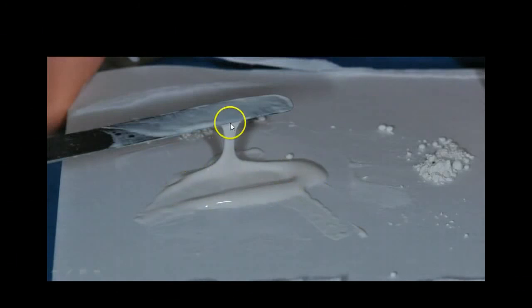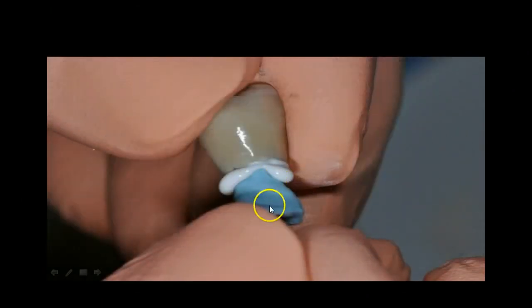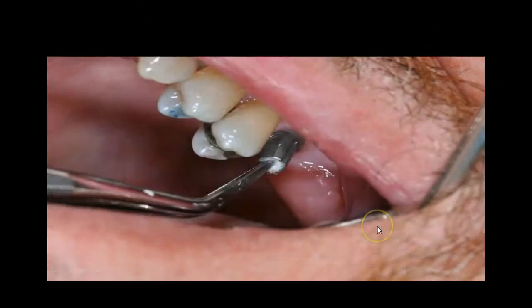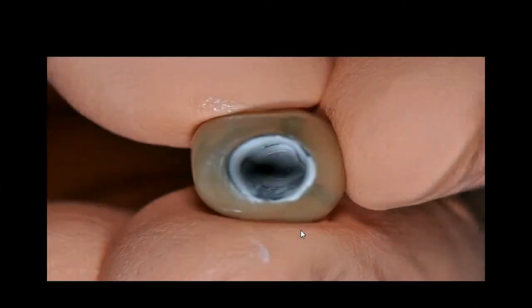Now here's, we used a, what's the name of it? Duralon material. And we mix up your cement, put that in there. And again, typically all that excess cement would be going underneath the tissue, all right? But what we did is we used a little quick tip, and now we got our custom little die that we made and put that in there. And obviously we had already put the cotton and so forth, or PVS in there.